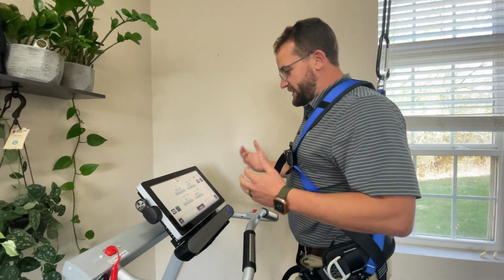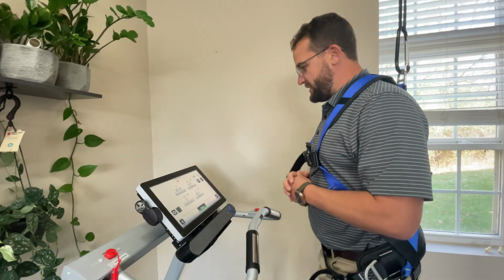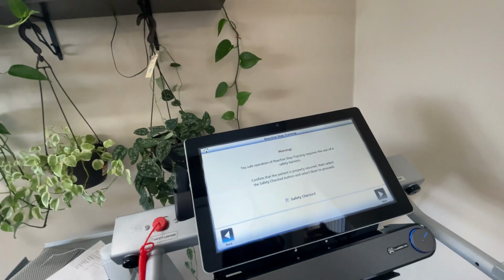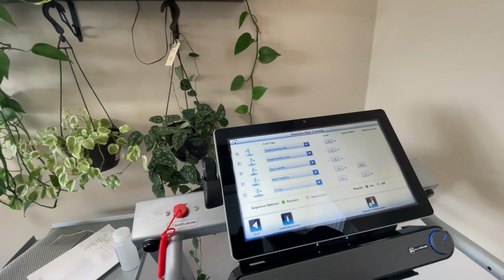Once they feel good and comfortable, the therapist will then go ahead and hit stop. All right, belt comes to a nice easy stop. We go to next. Again, the safety warning is always going to ask, are they safety checked? Safety harness in, you hit safety check, yes, and away we go.